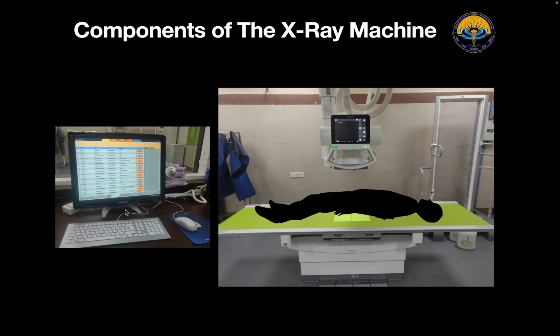And we also have a transformer rectifier combination, the X-ray generator, over here. The importance of that is that it will provide a constant, uniform supply to the system.